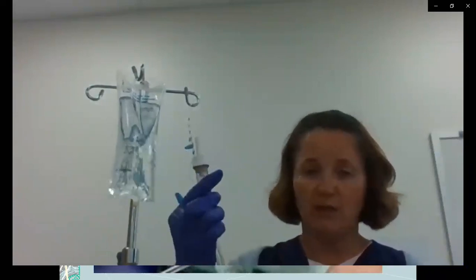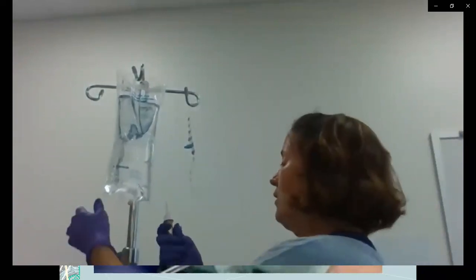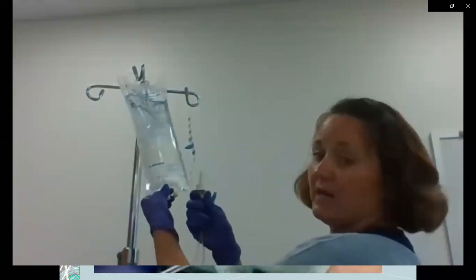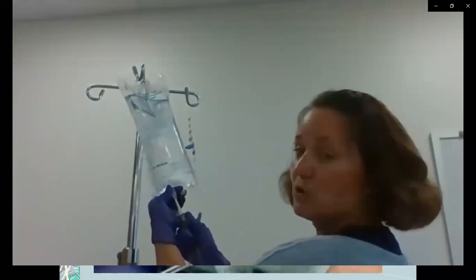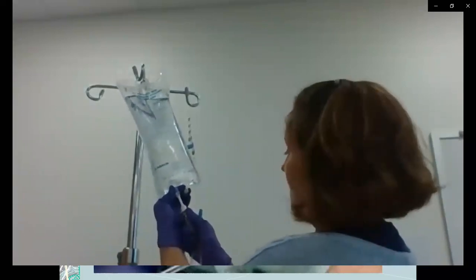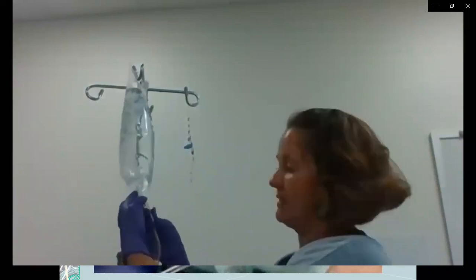And then this is sterile right now underneath here, so we don't want to touch it. We're going to pull the end off of our primary tubing. Again, this tip is clean, it's sterile. So not just clean, but sterile clean. Now we're not going to touch them to anything else except for each other. So just carefully, I'm going to try to turn it so you can see, carefully going in through here, and then just twist it to gain access there.